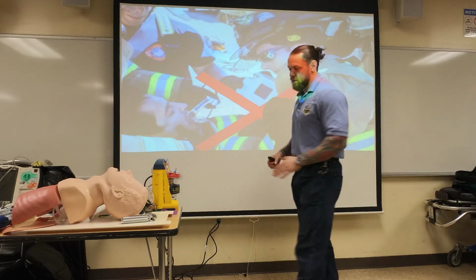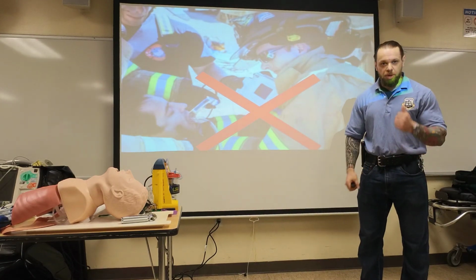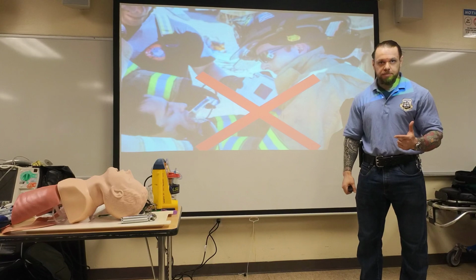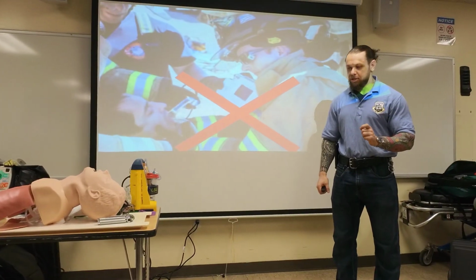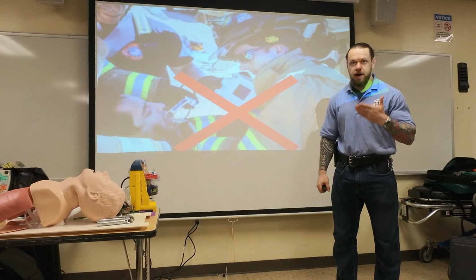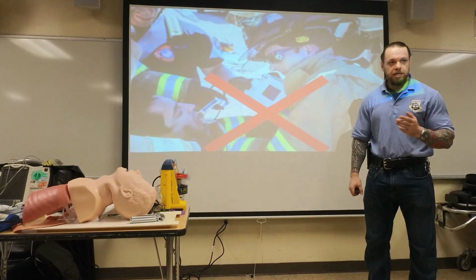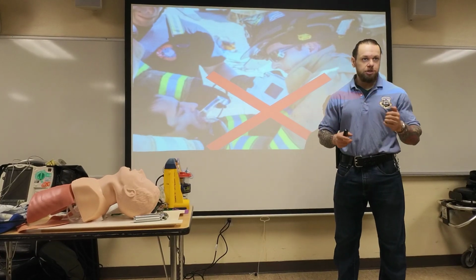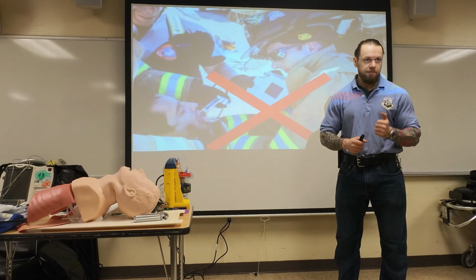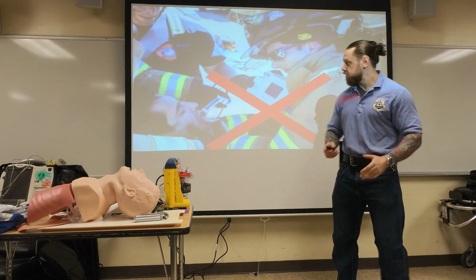We're going to spend this time to talk about the proper way to perform endotracheal intubation. The name of it is DL intubation. DL is direct laryngoscopy, right? And what that means is that you have to visually see the structures. There's no video instruments, no video laryngoscope like you have right now. So we're going to visually see.